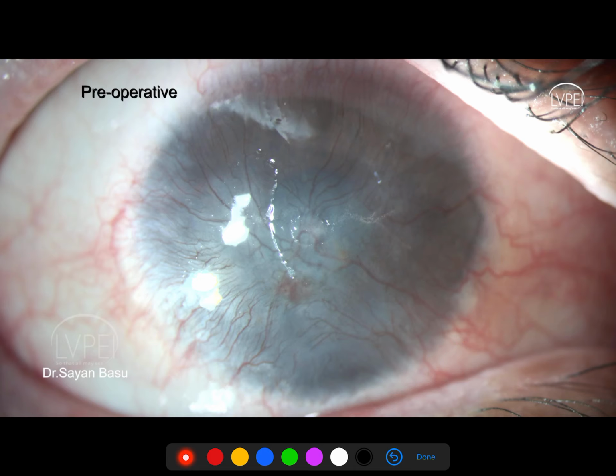You can obviously make out very clearly from this photograph that it's a wet eye with good luster. The lids look normal. We can assume here that the closure is complete. The eye is not dry at all. And these are the perfect preconditions for SLET. The other thing that you can notice, and this is very subtle and I want you to pay attention here, is that you can faintly make out the pupillary border over here in this photograph, which basically means that the underlying stroma, the stroma under this pannus, is translucent, is not opaque, which means that if I can do the surgery properly, when the epithelial surface is restored, the patient will recover good vision and also good cosmesis.